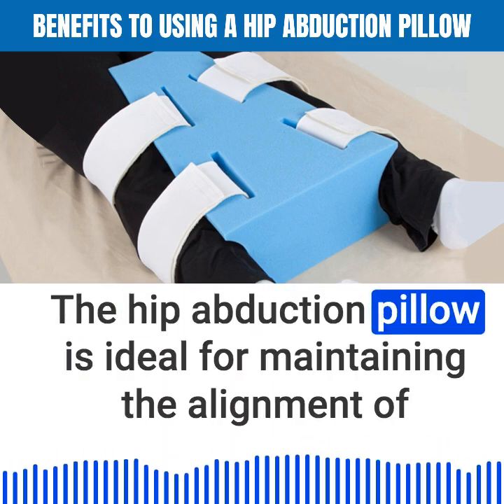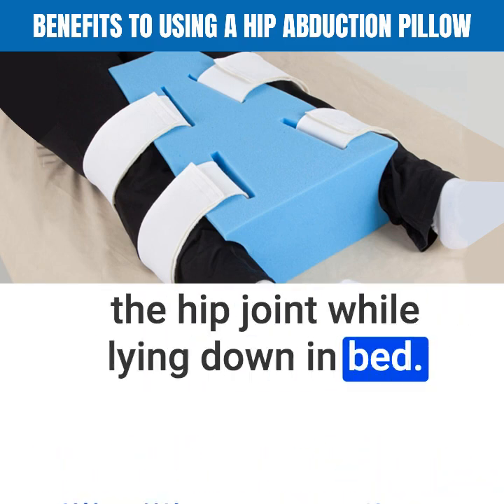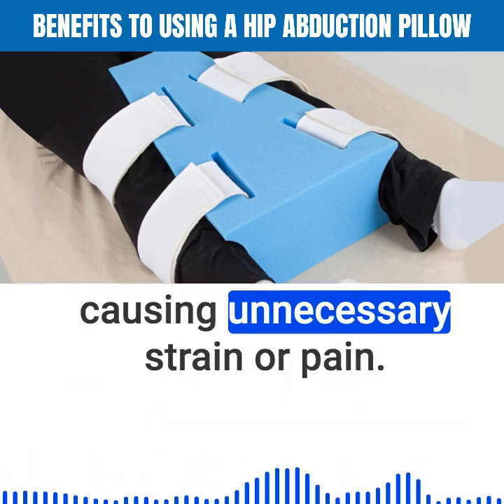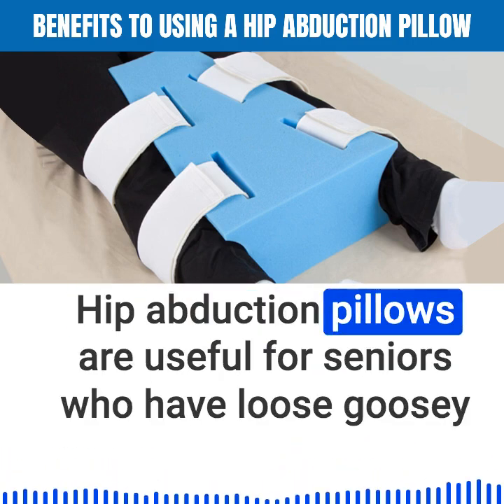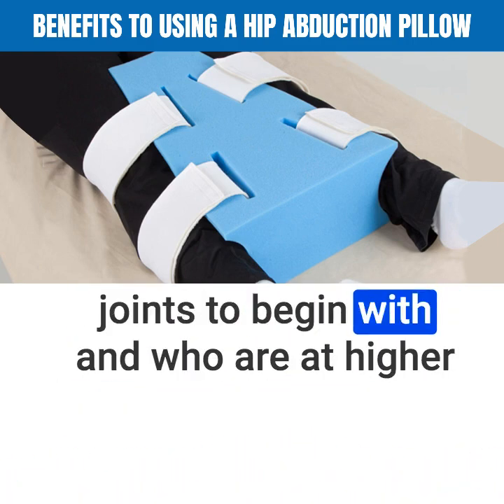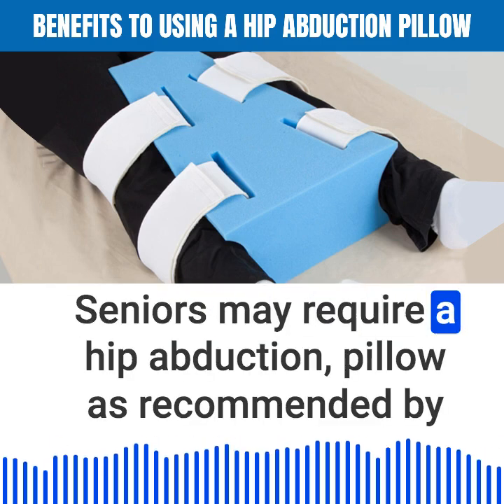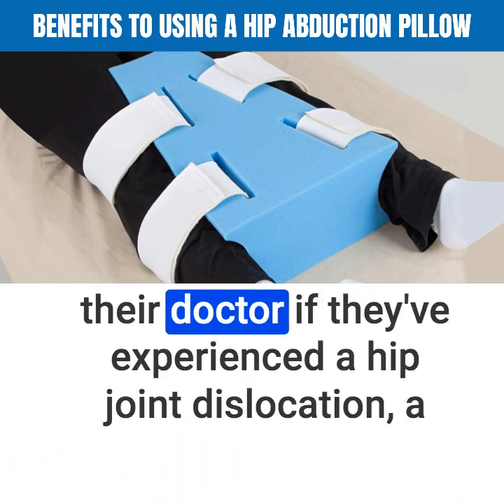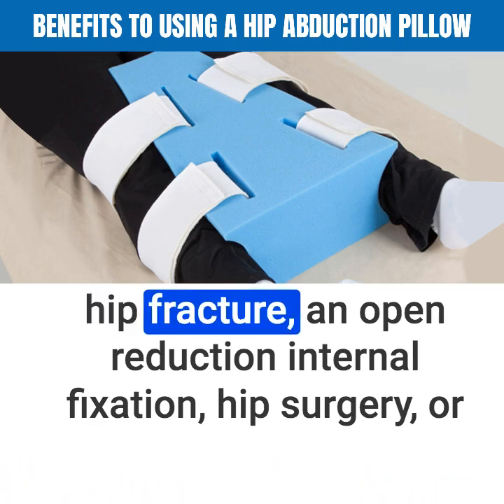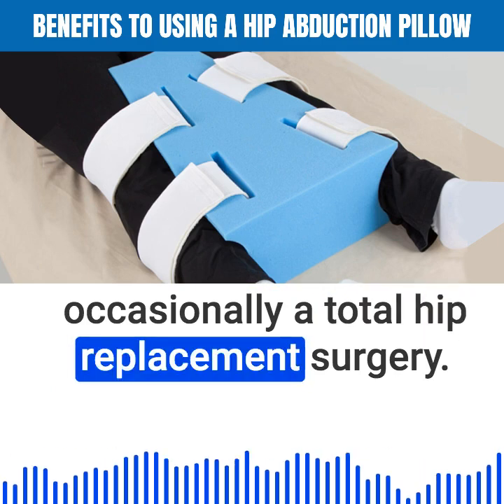The hip abduction pillow is ideal for maintaining the alignment of the hip joint while lying down in bed, helping prevent the new joint from sliding out of place or causing unnecessary strain or pain. These pillows are useful for seniors who have loose joints and are at higher risk for popping the hip joint out of socket. Seniors may require a hip abduction pillow if they have experienced a hip joint dislocation, a hip fracture, an open reduction internal fixation hip surgery, or occasionally a total hip replacement surgery.